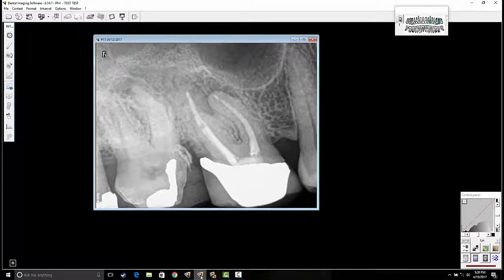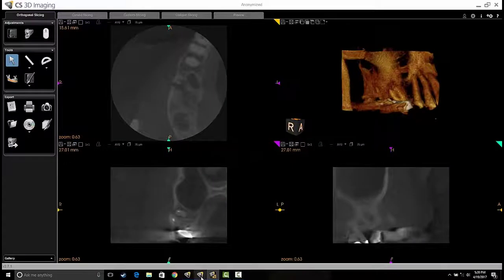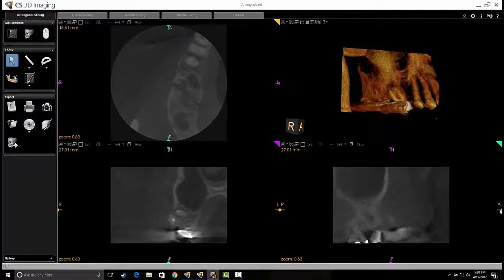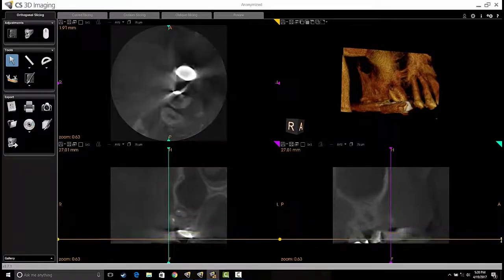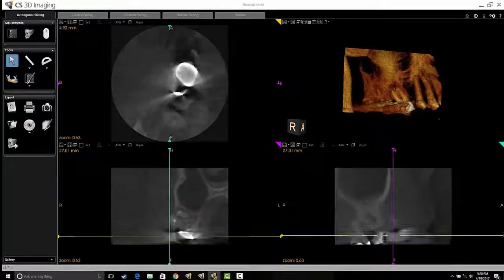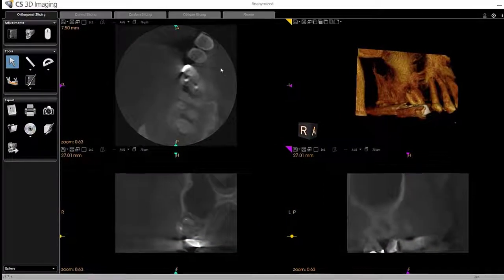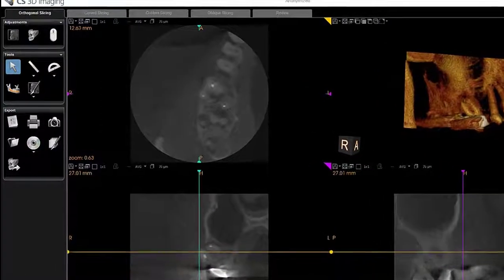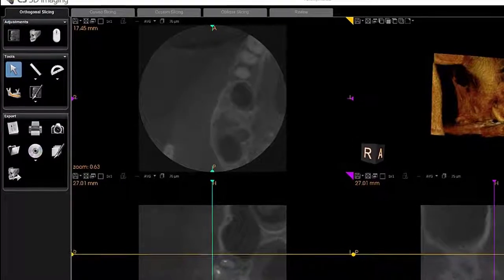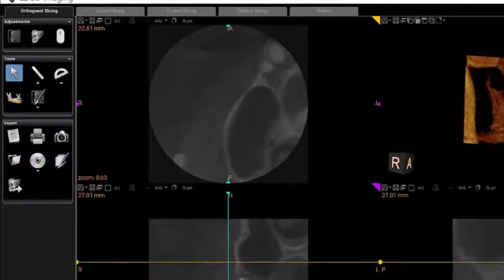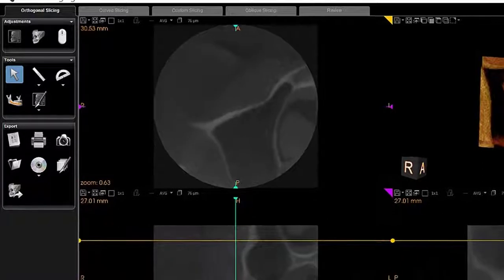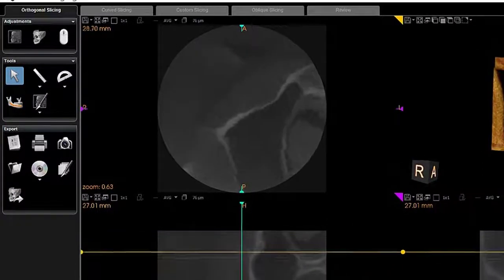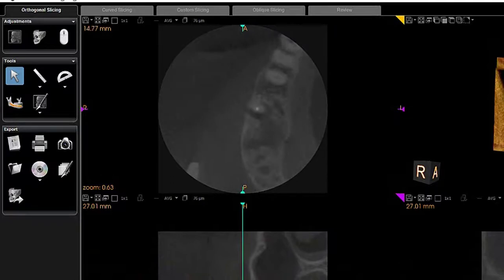I'm going to go over to the scan now. Here we are in the orthogonal slice, and I'm just going to do a quick view throughout to see if there's any asymmetries in the bone or anywhere in the sinus — something that just looks abnormal. I'm not really looking at the teeth specifically right now; I just want to get an idea overall of what's in the volume. I don't see anything unusual there, so I'm going to start focusing on the teeth now.